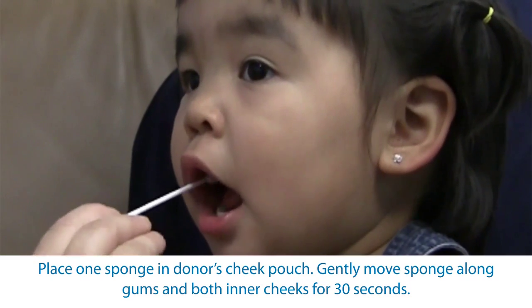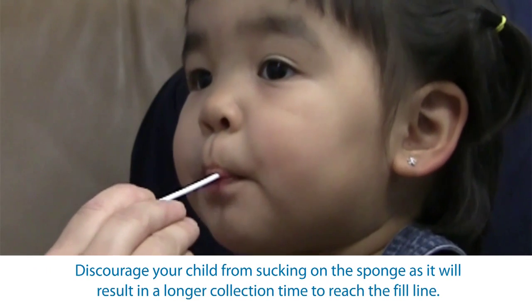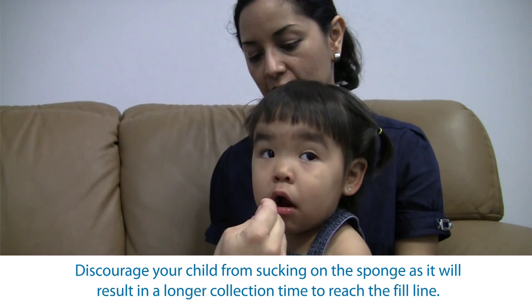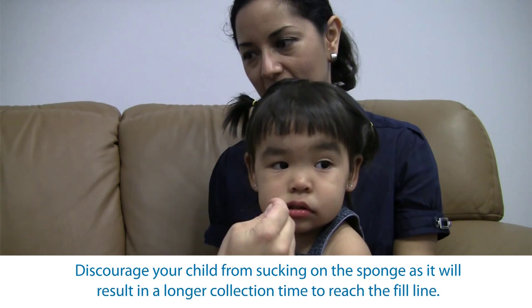Gently move the sponge along the gums and inner cheeks on both sides of the mouth for 30 seconds to soak up as much saliva as possible. Assistance may be required to hold your child during the collection.